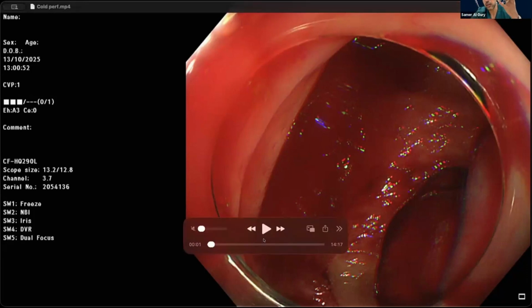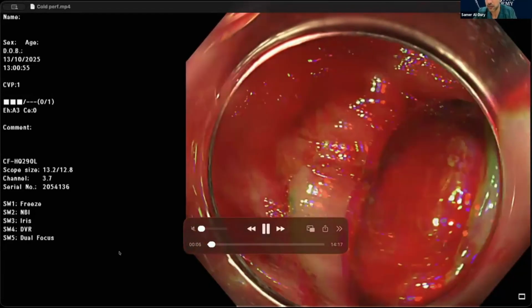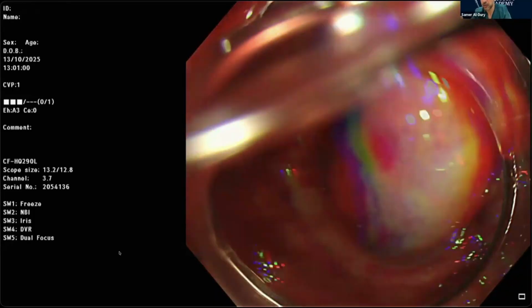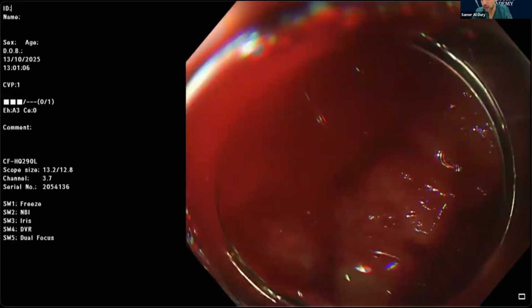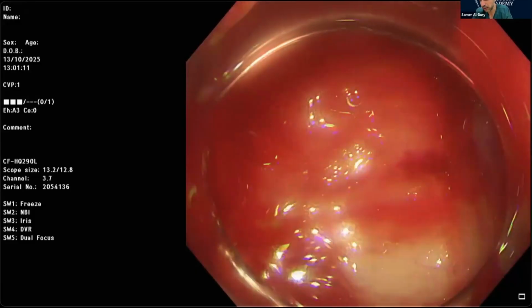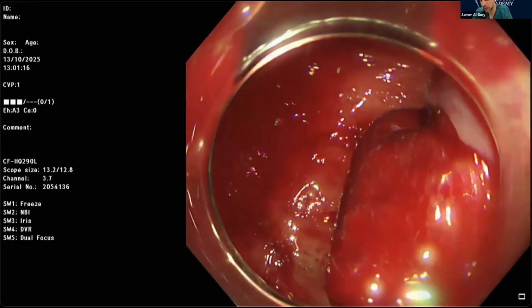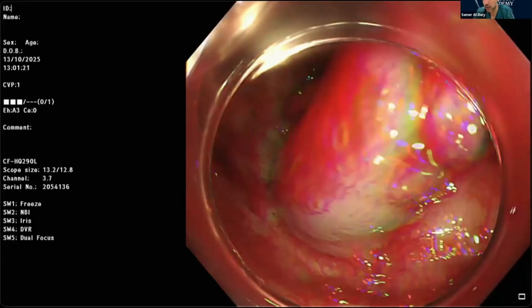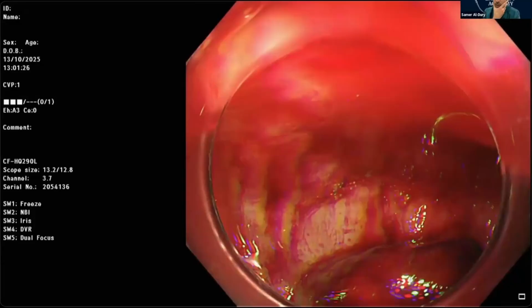When I came in, I started recording what was happening. And this is what you see right there, right at the hepatic flexure. And you see the amount of edema that you're getting. It looks much worse than it should. But you see the edema that happened because of continuous tugging at the polyp, which was definitely less than 1 centimeter. You see the size of the area.